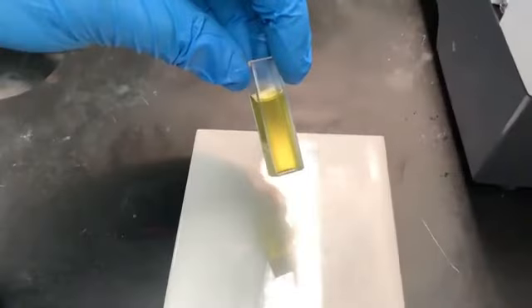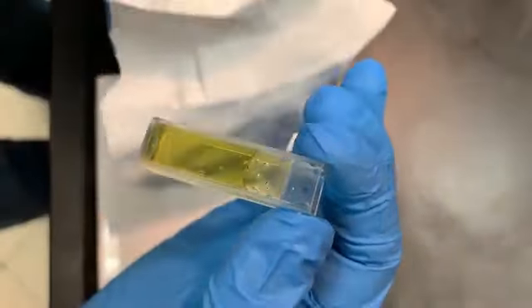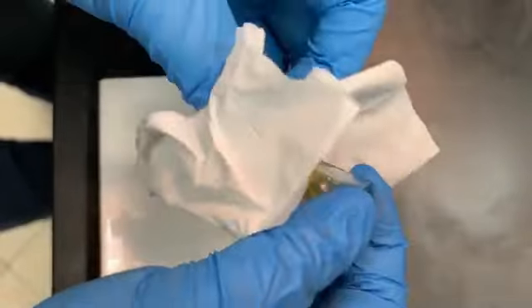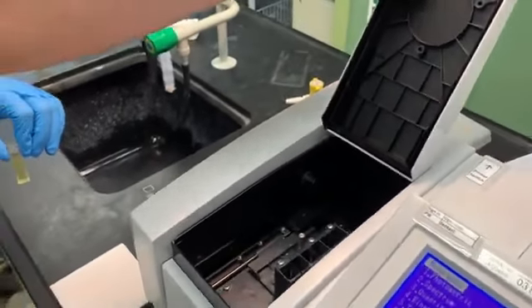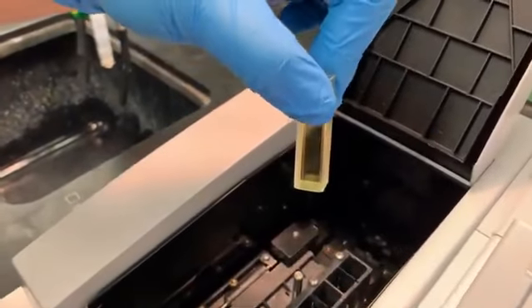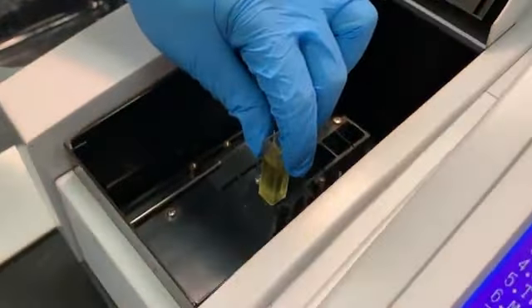Now let's look into the principle of a biochemistry analyzer machine. An automatic biochemical analyzer utilizes this kind of reaction and converts the quantity of a specific substance in blood into an amount of color change for measurement. The analysis method of measuring the amount of color change is called the colorimetric analysis method. The origin of this method is quite old, and the shading of colors was originally evaluated by the naked eye. It is a method that has been used since the age of alchemy.